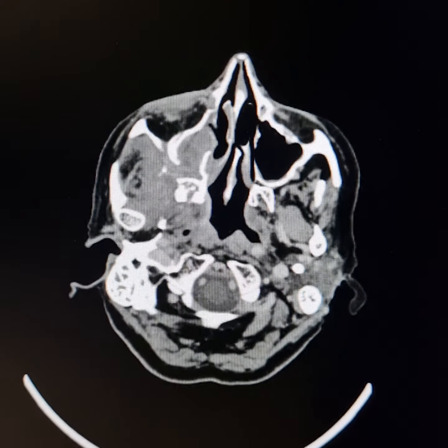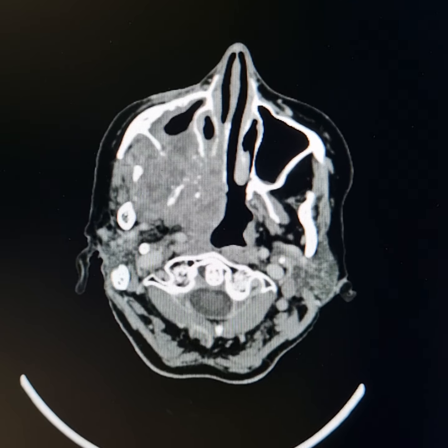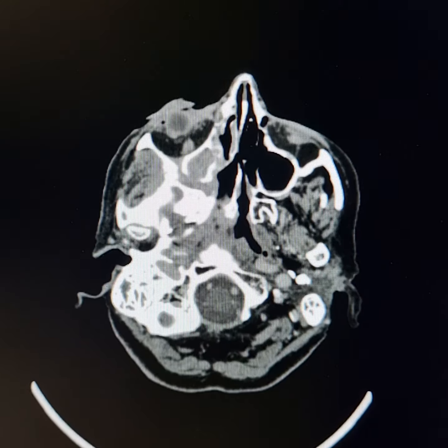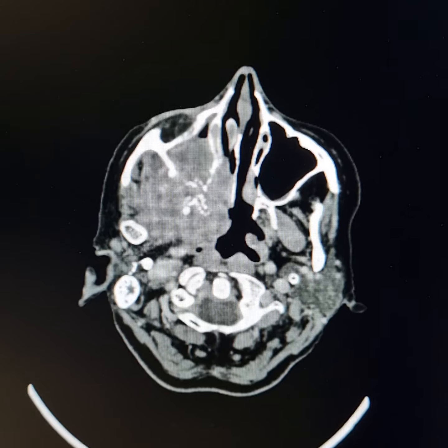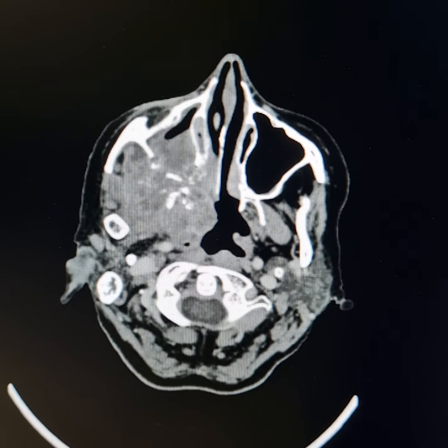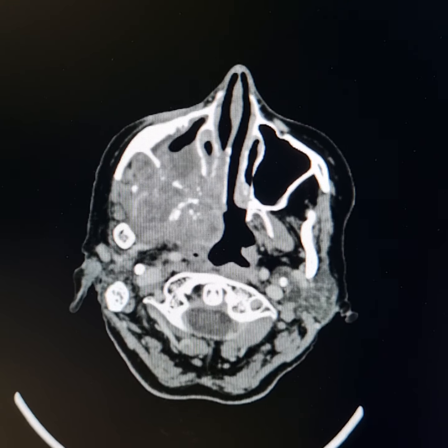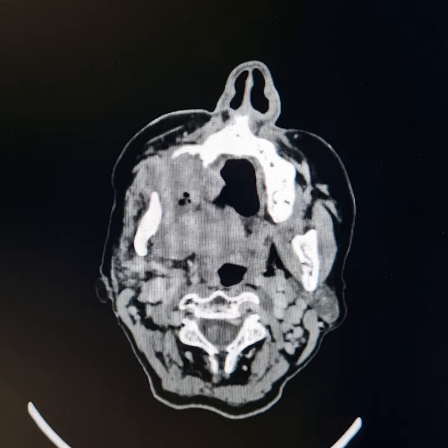I just want to show you the extent of the lesion because we do come across such lesions quite frequently during our routine life. But it becomes very difficult to explain these lesions so that it becomes easier for the clinician or the surgeon to comprehend the lesion. In my humble opinion, the report should be such that if one reads the report with closed eyes, he should be able to make out the exact extent of the lesion as the reporting radiologist.